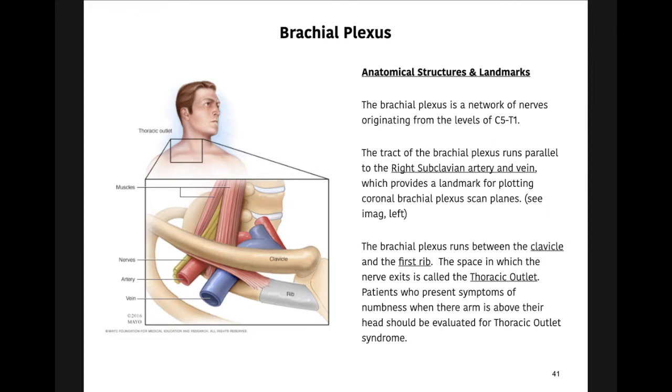We essentially align with that landmark, and if you scroll through your axials, you'll be able to see it moving and know exactly where to plot those scans. On the image to the left we have our right subclavian artery. This also applies to the left side, where it follows the left subclavian artery — right side, left side, nothing different.